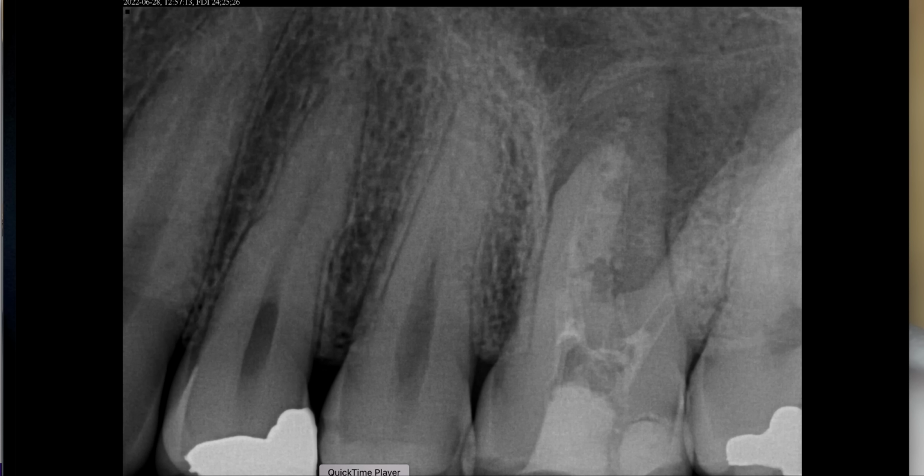Now, I used Fuji 2, which is a resin-modified glass ionomer cement. It's light cured and also auto cure. One of the things that's been shown in the literature a number of times, though I haven't read it since my residency, is keeping a thick restoration, a minimum of roughly 4 millimeters thick. So that's what we're doing here. It's a really thick restoration because we don't want any leakage, since we plan on leaving it for a long time. We've got at least a 6 millimeter thick restoration.